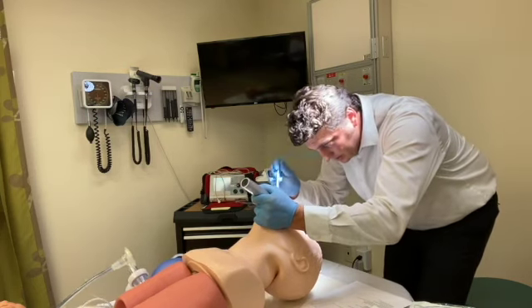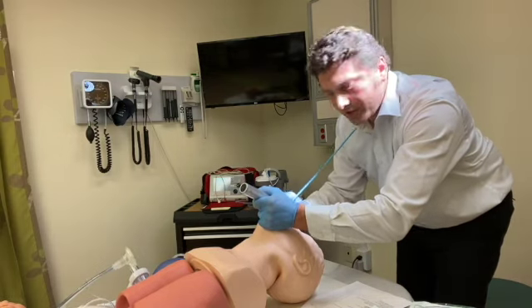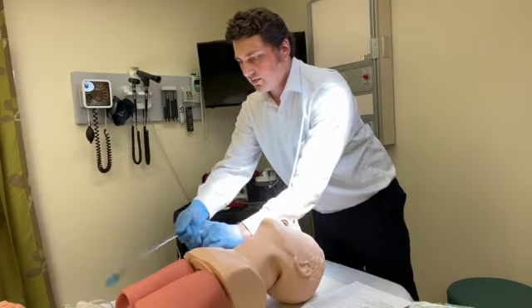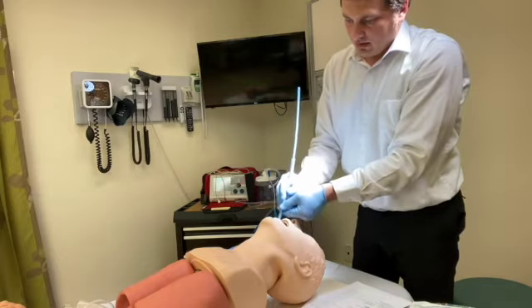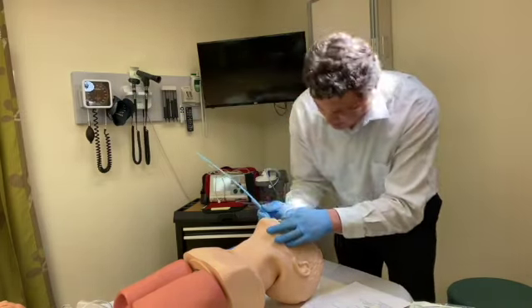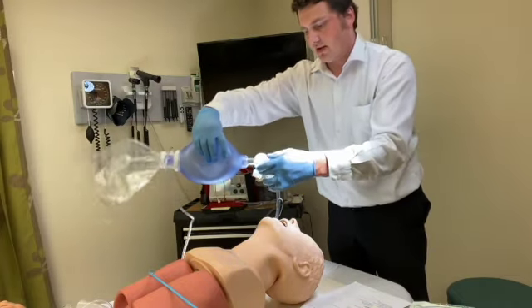All right, so same placement, and sometimes you have to do this blind if things are really messy. So stick it right in. You might feel the tracheal rings on this. Now you want to take the ET tube that we had on here before, and then you place it directly over the bougie. So you slide it, following the bougie into the vocal cords as a guide wire. Your goal is about 20 centimeters at the mouth. You go up to 24 based on the person. Remove the bougie, and then now you're going to want to place the bag valve mask for confirmation.